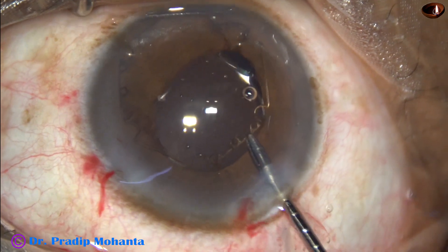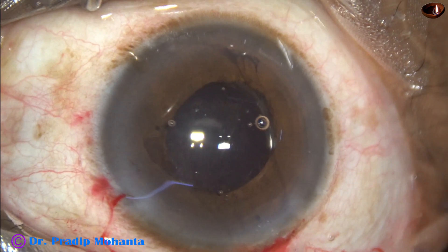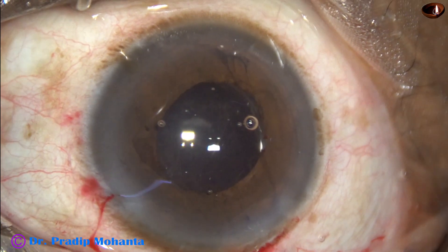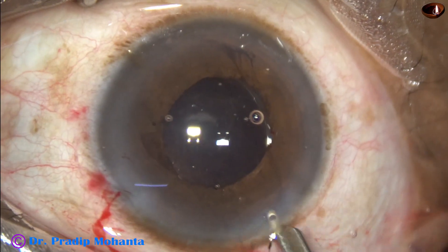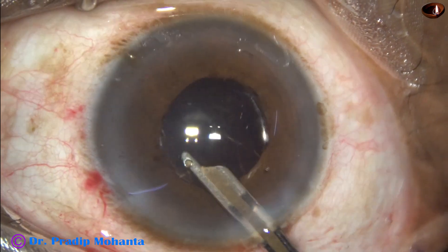Now see the removal of BHEX — it is so easy using the BHEX forceps. The pupil is round, there is no sphincter damage, and only two wounds were used: the side port and the main wound.